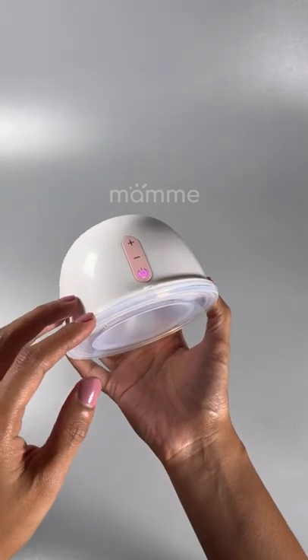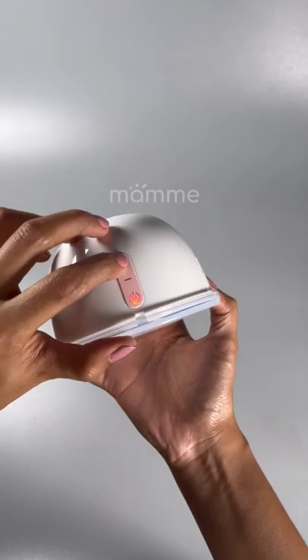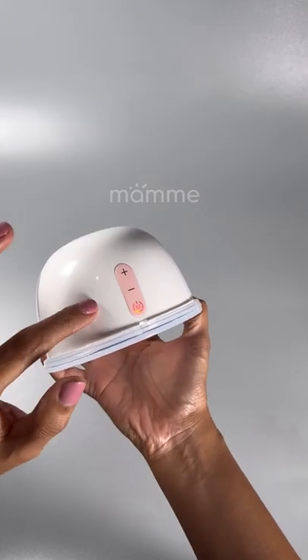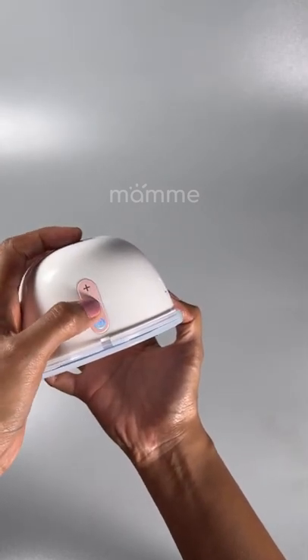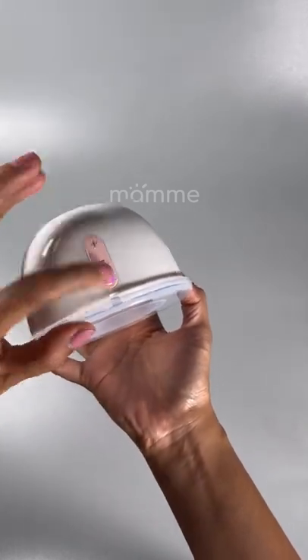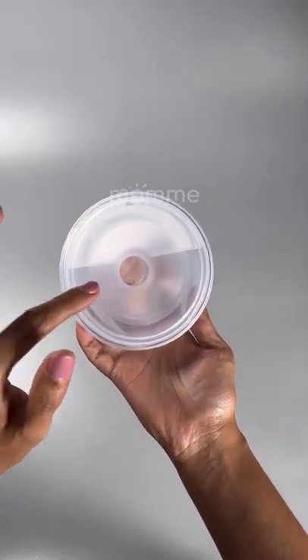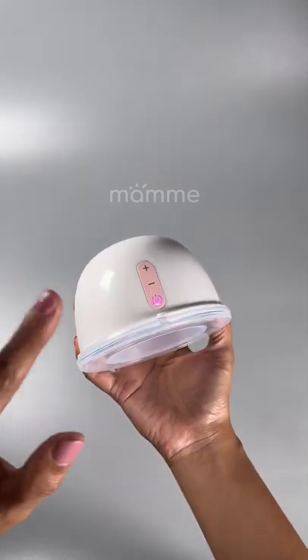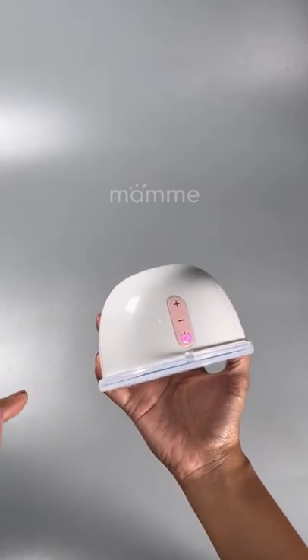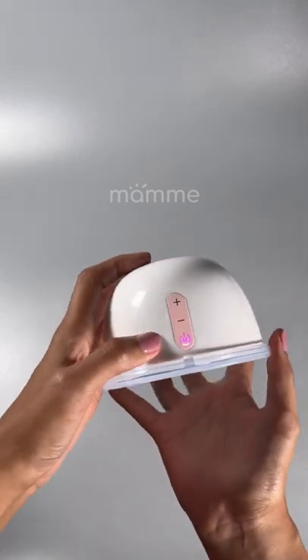What if, mami, bakit para mas malakas pa si massage mode? Pwedeng-pwede yun. Kasi, sinet mo to the highest level ang massage mode mo, and then sinet mo to the lowest level ang expression mode mo. So, kapag nag-mix mode ka, it looks like this. O, diba? Para mas malakas pa si massage mode mo. So, remember that for the mix mode, it is the combination of the last level ng expression mode mo and massage mode.